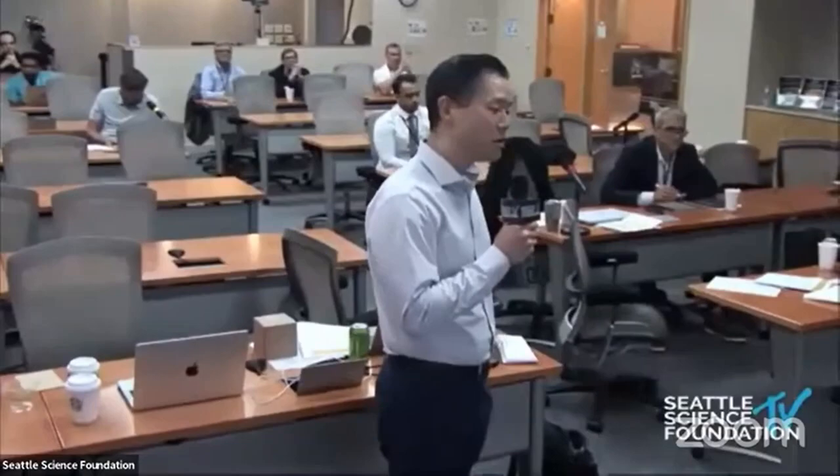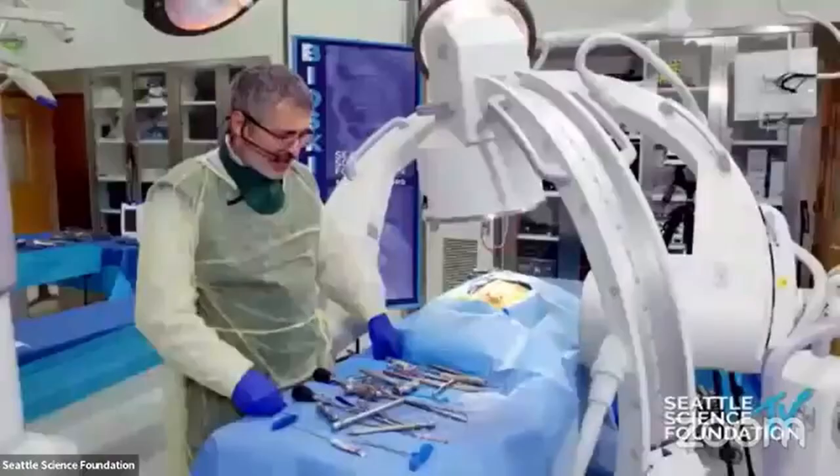You've been doing this now for 12 years. I'm sure your technique has evolved over time. For someone who's a novice, I'd feel a little uncomfortable because everything's done blindly. It looks very safe here, but what if the foramen was fairly collapsed — particularly in scoliosis cases — do you recommend doing it on the convex side where the foramen is a little bit more open?